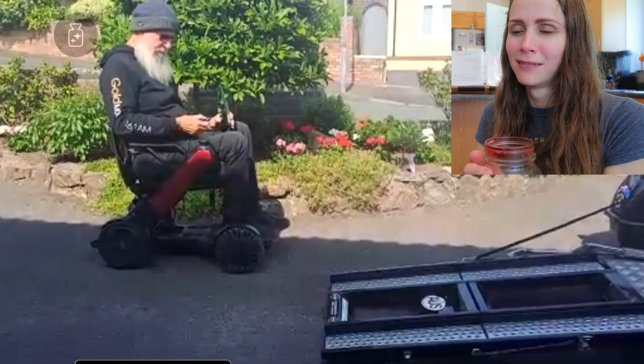It'll also climb steps this high — it'll do several steps actually, because it just pushes from the back. It's amazing. For the price it's just great. Obviously you need a manual wheelchair as well, but yeah, it's great.